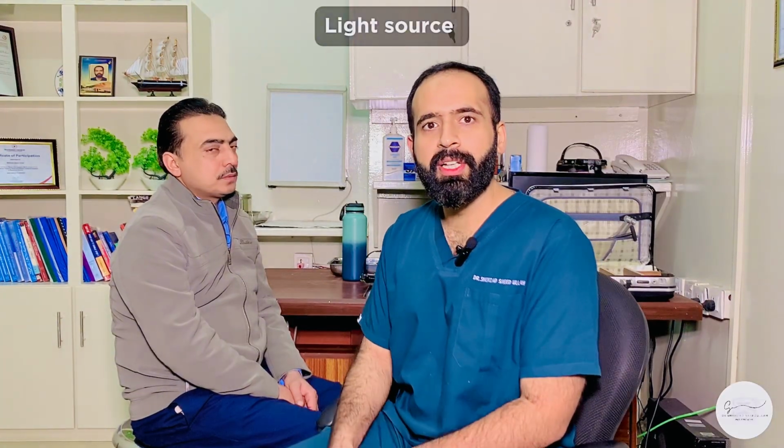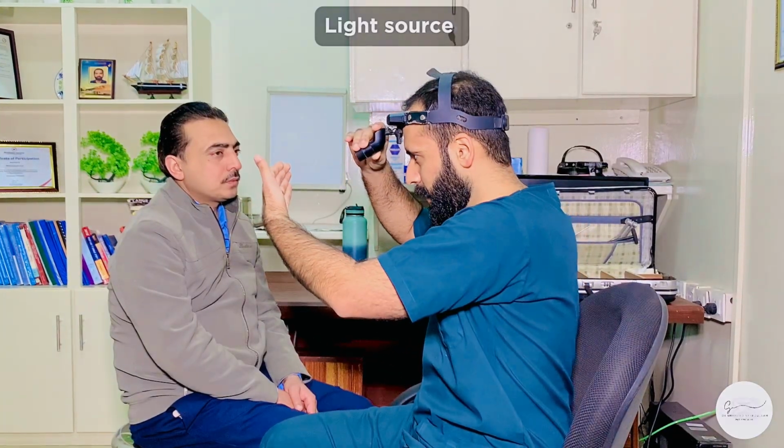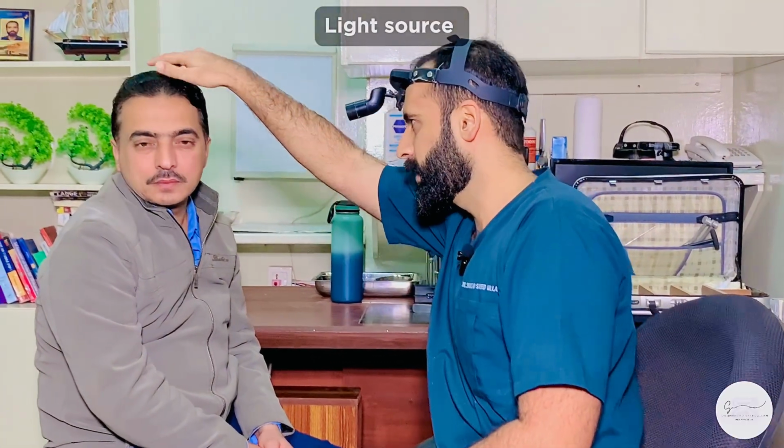And then comes a light source. For any examination, you need very good illumination. So the light source that we use in ENT is a headlight. So we put on the headlight, we adjust it and we turn it on and we focus it on the place that we want to examine. So the command in this patient is to examine the ears.